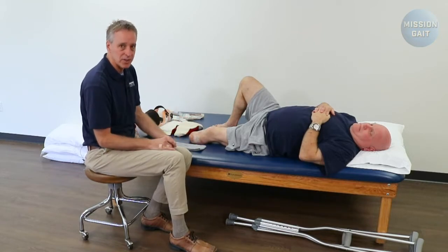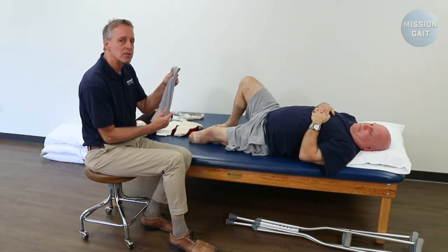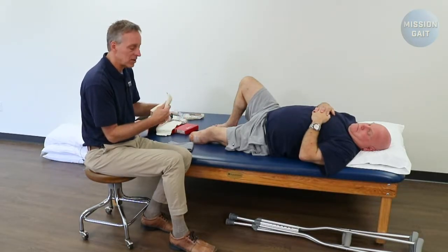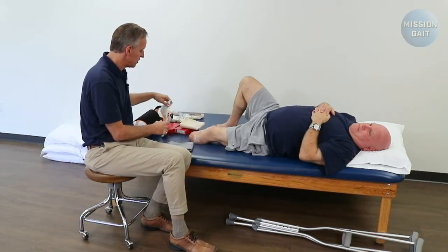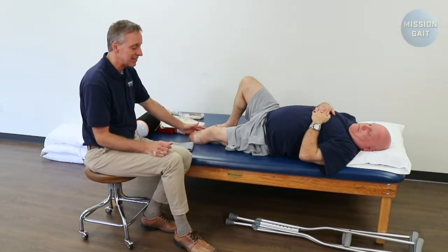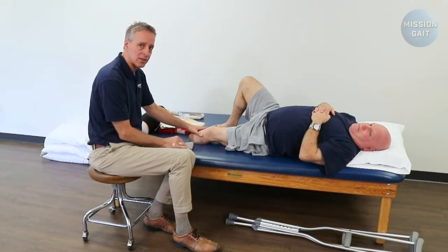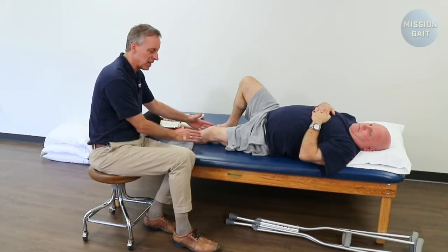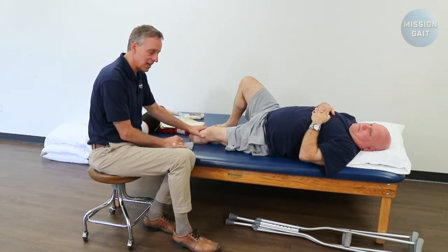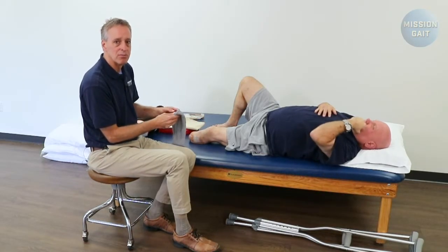The shrinker is just more simple to use. There are really a number of different styles of shrinker. Compressy Grip is probably the most common. However, if you need firmer, thicker, more compression, Trueform is a thicker shrinker. A Juzo shrinker is very lightweight and very soft. You choose based on your patient's needs and discomfort. If the limb is very sensitive with not a lot of swelling, a soft shrinker is fine. A limb that has a great deal of swelling or large dog ears needs more compression — the Trueform is best. In the middle is the Compressy Grip, which is why you see it used most often.